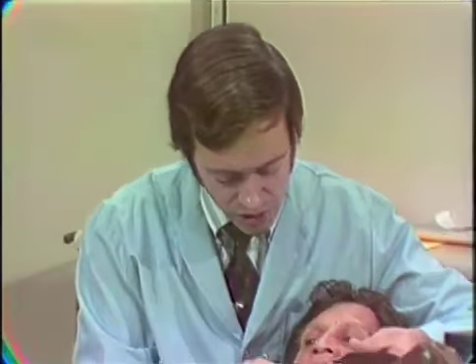In some areas, the cementum enamel junction may be obscured by calculus. If this is true, then it's necessary to go in there and remove the calculus before you can measure the relationship between the free gingival margin and the cementum enamel junction. And this would happen in an area such as this.